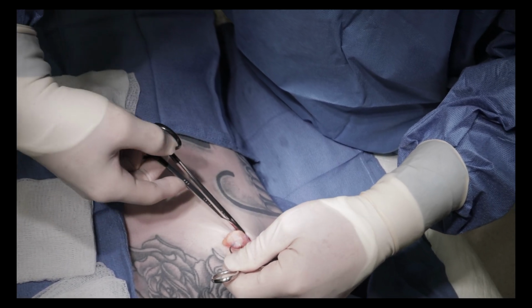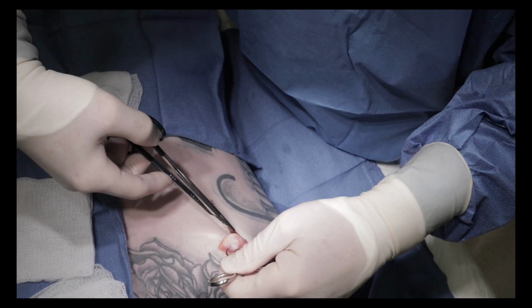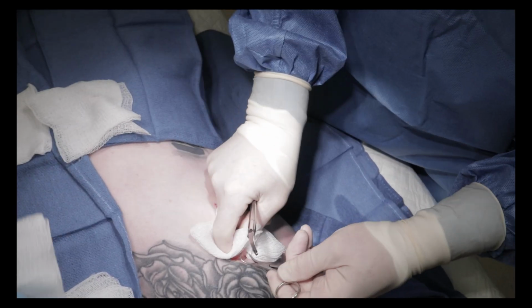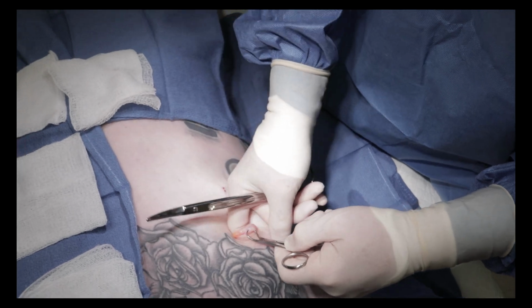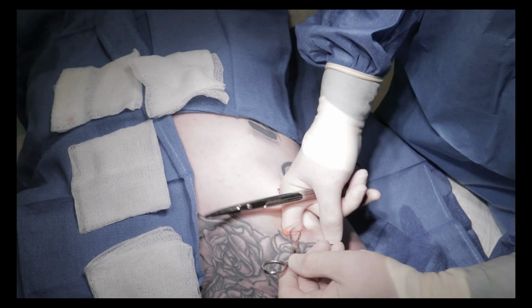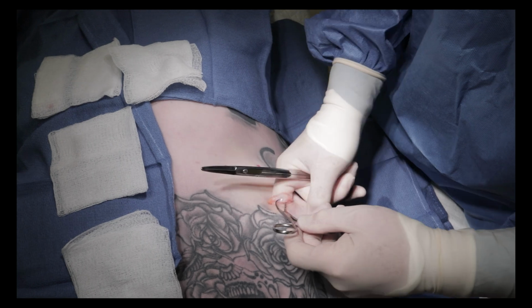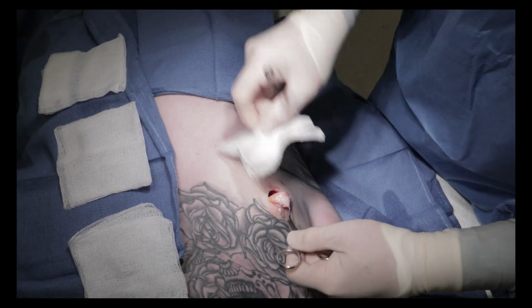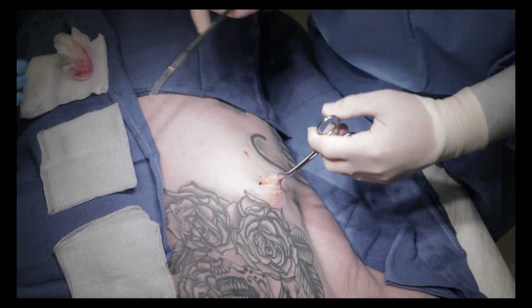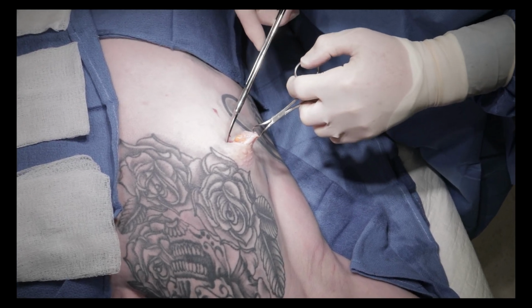So now I'm just searching for it around the tail as it heads into the armpit, into the lats in the back. Get there. Feel again. Nice. I can feel a nice lump of it here. Into the armpit. Free that up. Good. What else? Put this in there. Alright. Start to release it gently. Have patience.